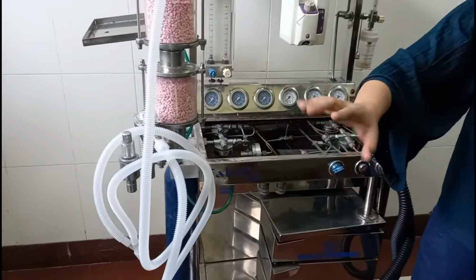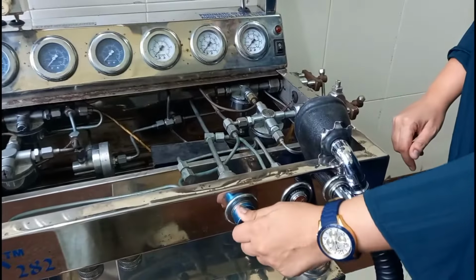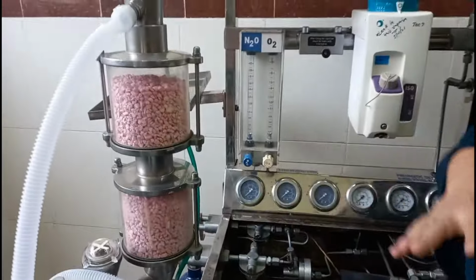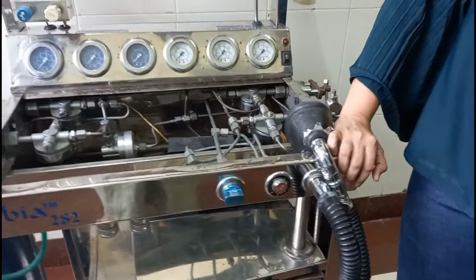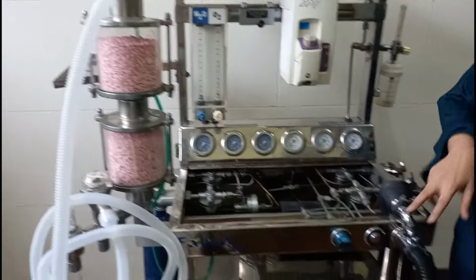This is a closed circuit. This closed circuit can be turned on from this. This is open and this is closed. So we can turn this machine from open circuit to a closed circuit which will include all of these parts. These new parts, in today's language, are the circle system, which will include the inspiratory valve, the expiratory valve, soda lime canisters, APL valve. So this all comes in the closed circuit.